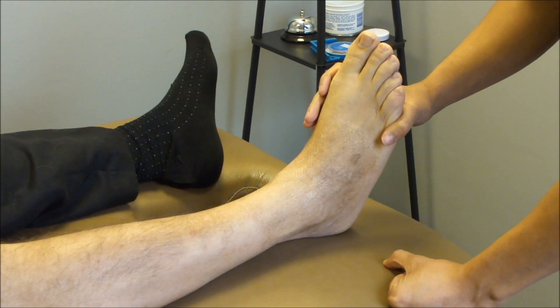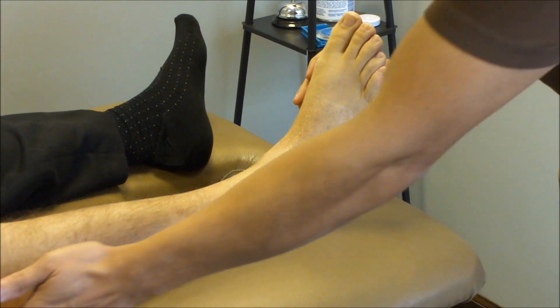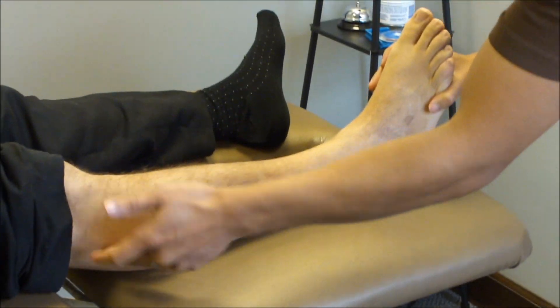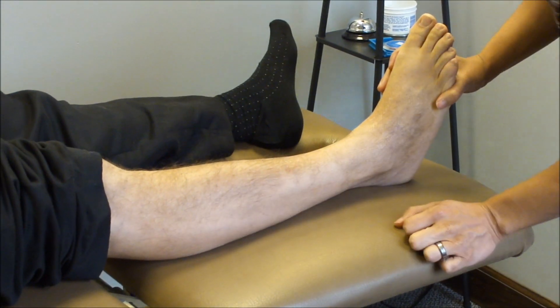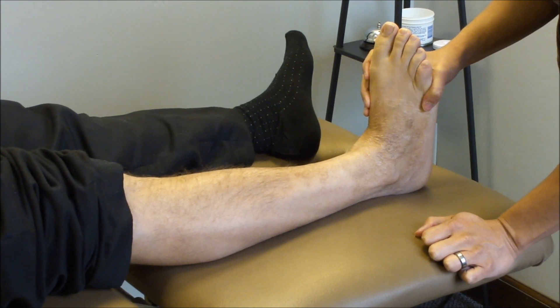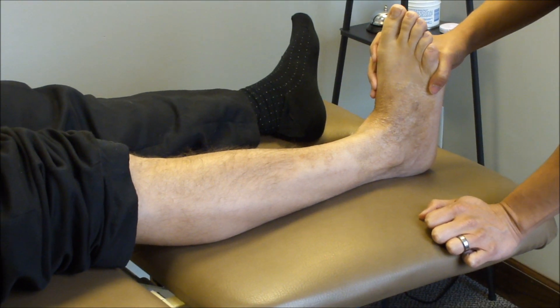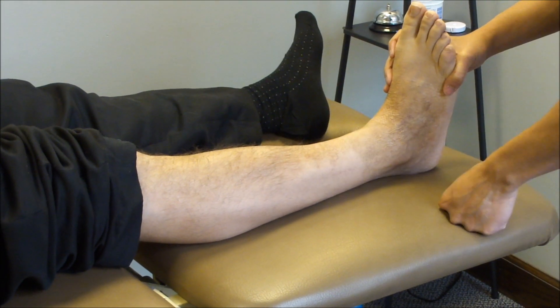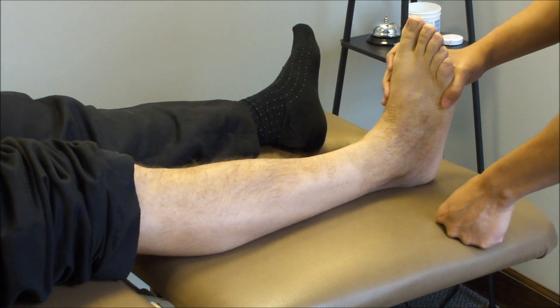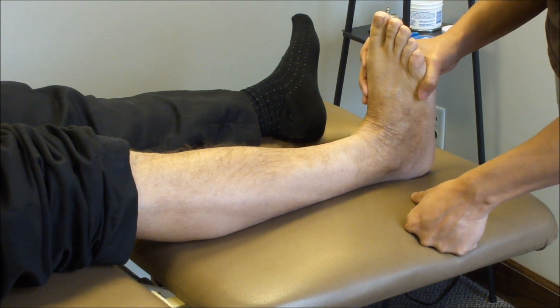Today I have a few techniques based on improving dorsiflexion by working on the fibular head and the calf. The patient today stepped in a deep fryer several years ago. After he peeled off his shoe and sock, he took off his skin as well. So he has some skin grafts and very limited dorsiflexion.